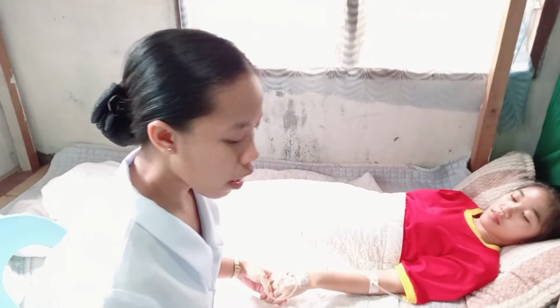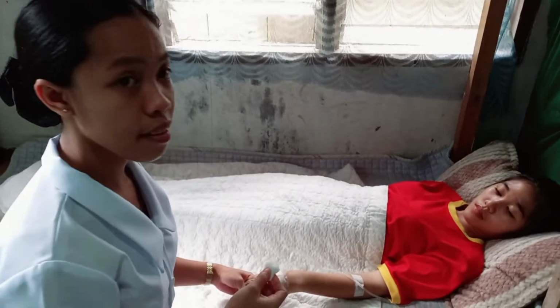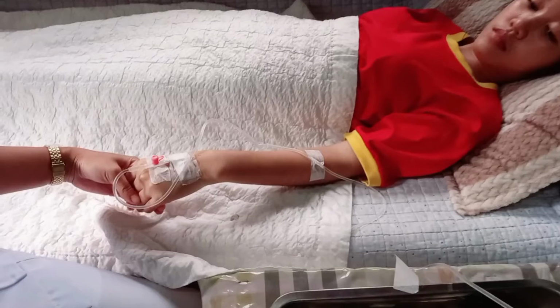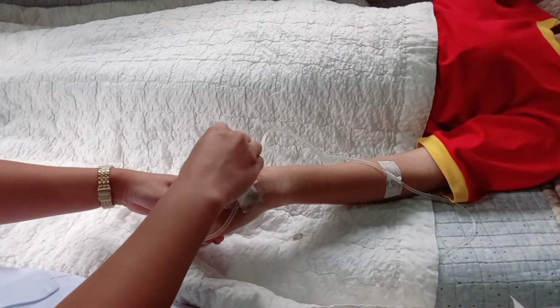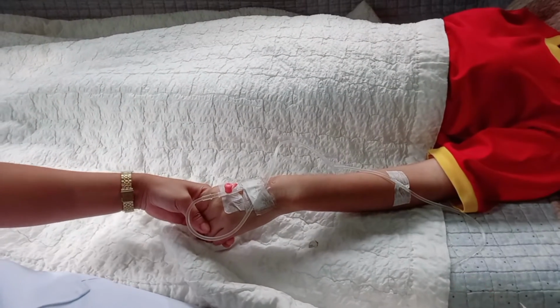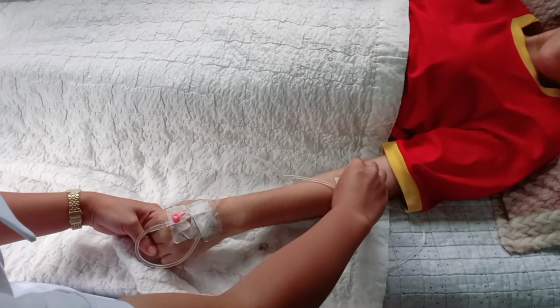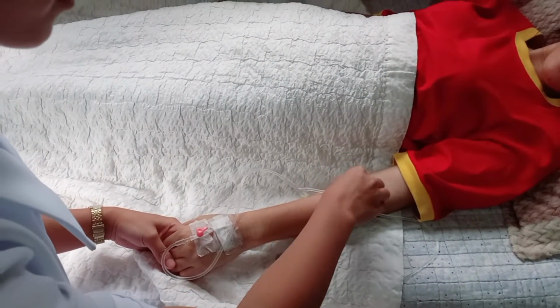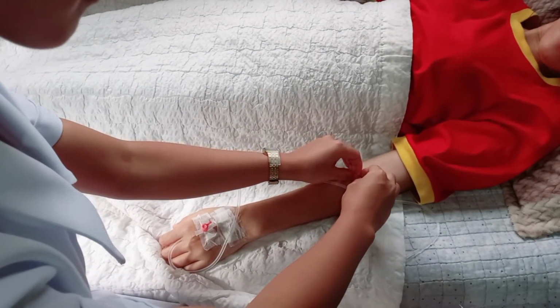With the use of the cotton ball with alcohol, we will apply it over the patient's plaster so that it will not stick to the patient's skin and to make it easier to remove. We will now release the anchorage of the arm, the tubing, and the needle. Make sure when removing the plaster that no hair is attached to the plaster.